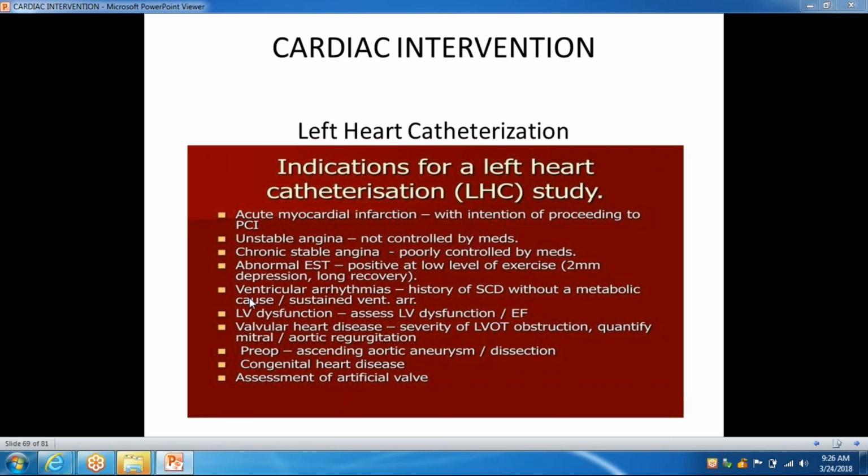time. So it is customary, if the patient is over age 40 and they have significant valvular disease, going to surgery, we would do a cardiac catheterization, an angiogram to look at the blood vessels around the heart. And then congenital heart disease, if these patients are going to surgery, you need to know what the congenital lesion looks like, so you can plan your surgery.